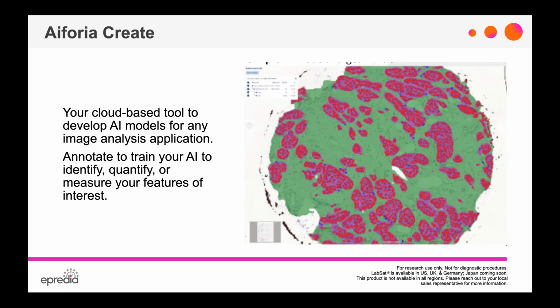You can see multiples. You can have a stroma that's particularly labeled in green, and you want to be able to see what the percentages of that are. And then maybe I have an area of interest, a particular tumor type or disease state.